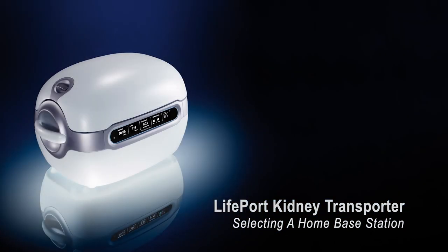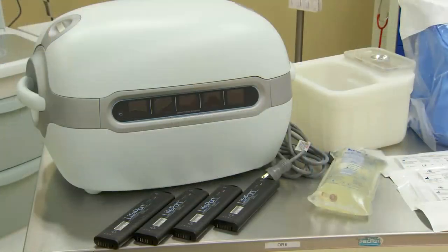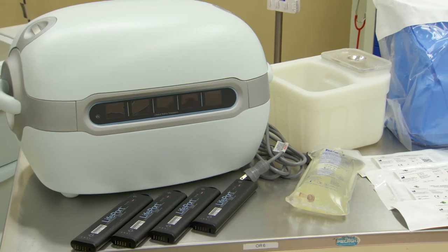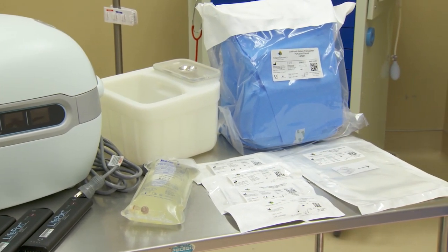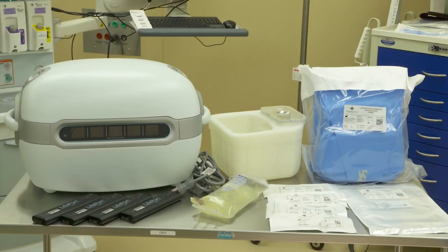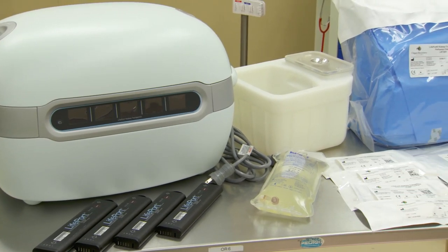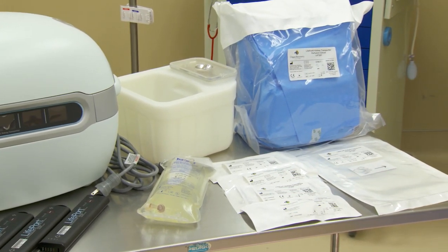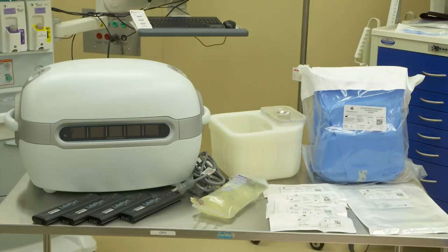Selecting a home base for your Lifeport Kidney Transporters and associated disposable supplies. When selecting a home base, there are several things to give consideration to. First and foremost is the ability to keep the Lifeport Kidney Transporters plugged into the wall to ensure a full battery charge. Also allow enough space for all your disposable products, and give consideration to packing a perfusion bag with a sampling of multiple different cannulas, sterile drapes, as well as the perfusion circuit.